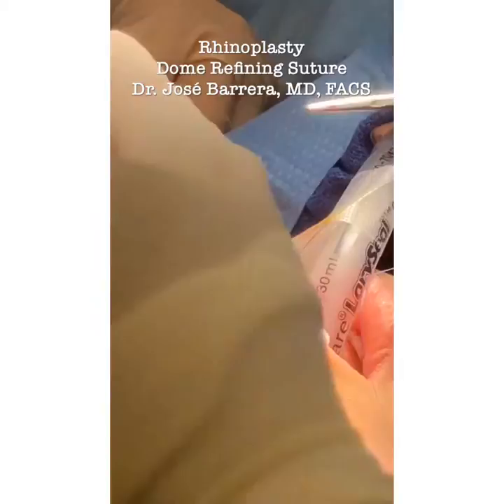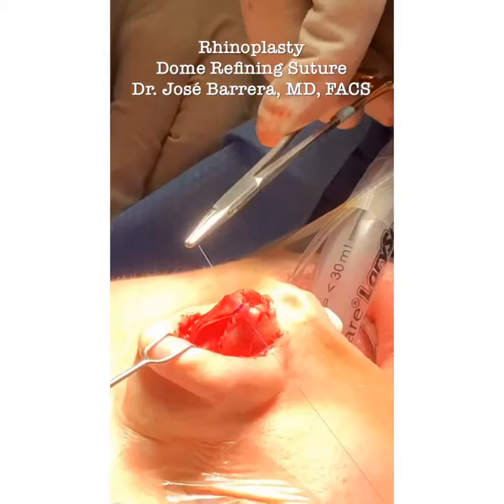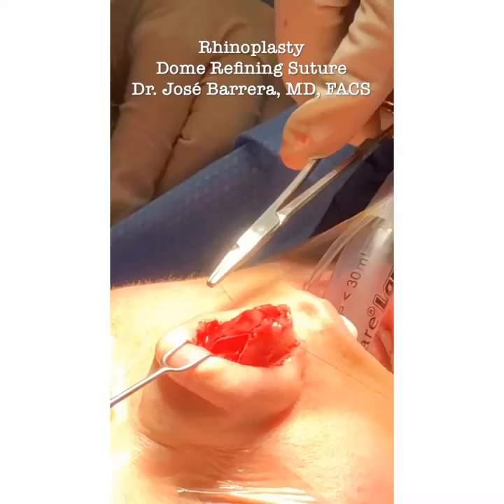Check the suture again. Looks good. Find this nasal tip here. Now that I've done that.